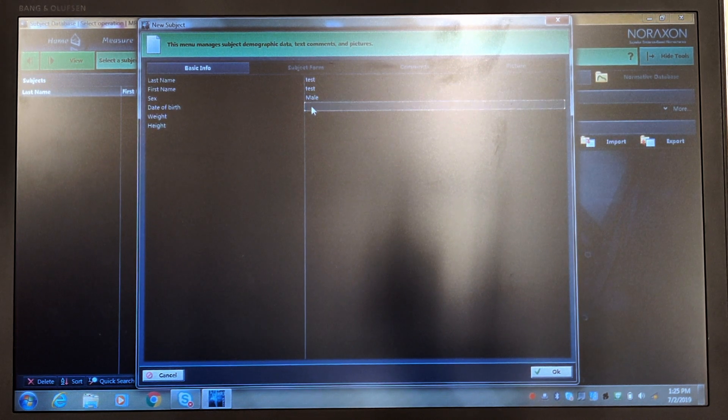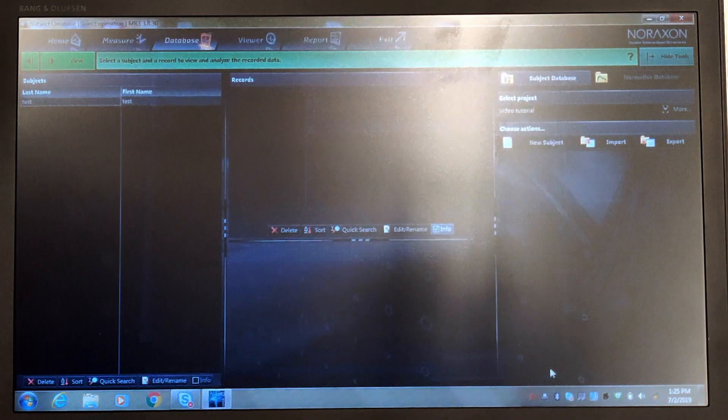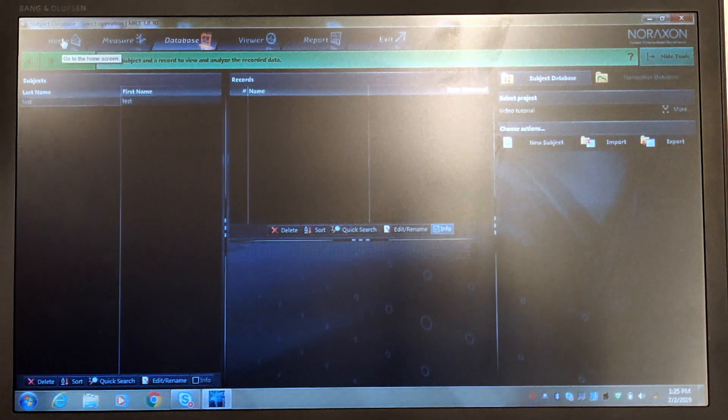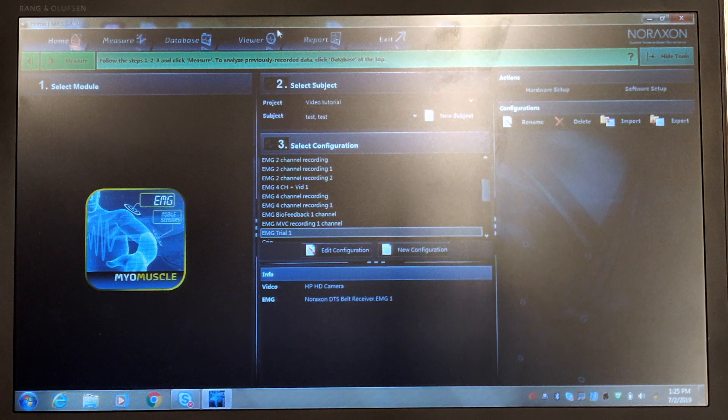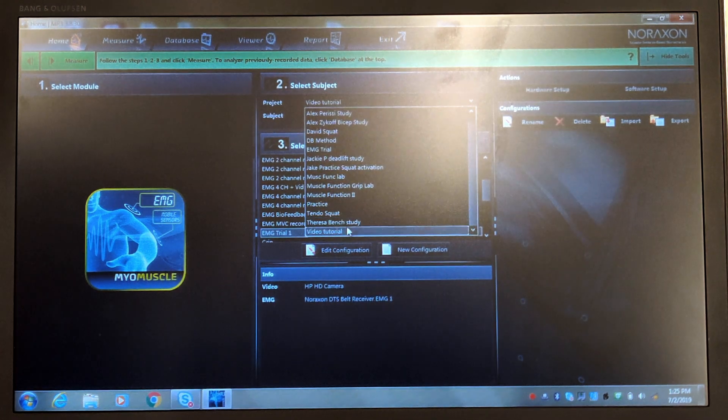We'll make them a male, their birth date can remain the same, weight is 150 pounds and height is 68 inches. Once you've input the data for your subject, click OK. Now we can go back to Home and select that specific project as well as the subject — so we've got Video Tutorial selected up here, and scroll down to Video Tutorial.